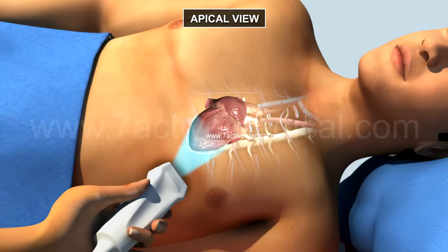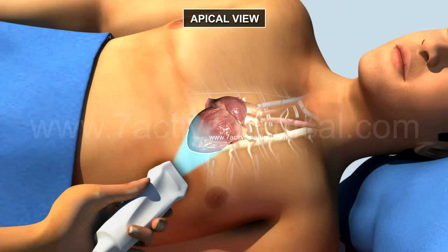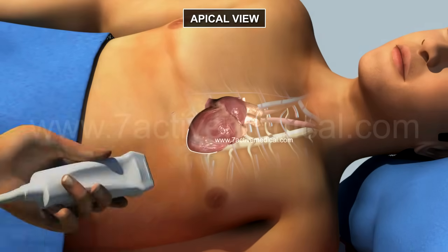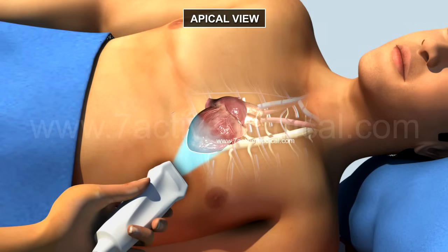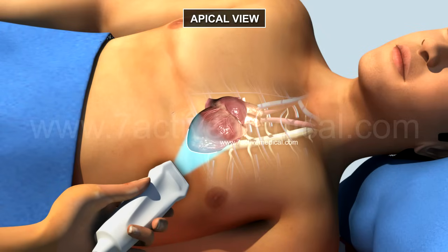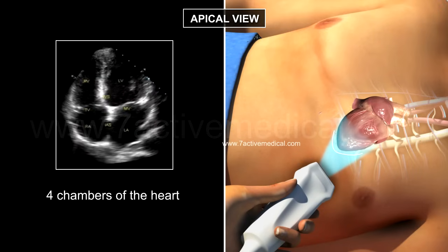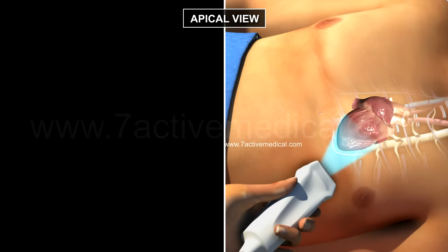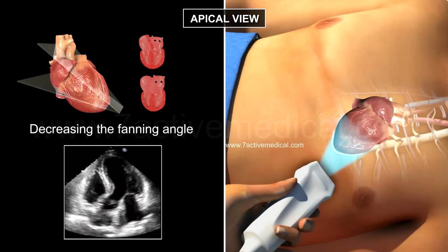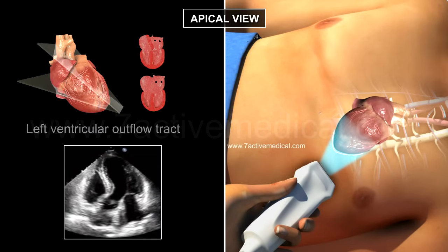3. Apical view. The probe is used to visualize all four chambers of the heart, including the left ventricular outflow tract, and to estimate the hemodynamics with a color Doppler. The probe is placed below the left nipple and pointed towards the right shoulder. Initially, all four chambers of the heart will be visible, but by decreasing the fanning angle, even the left ventricular outflow tract becomes visible.